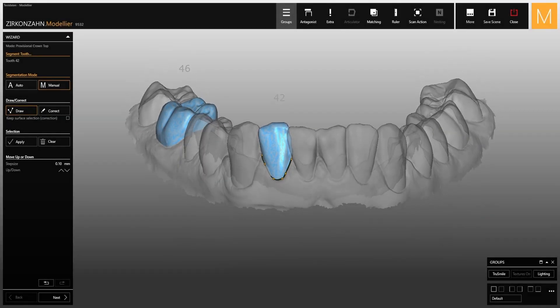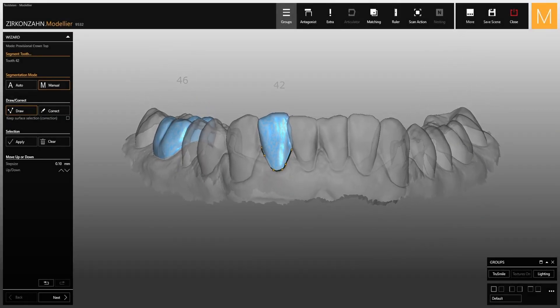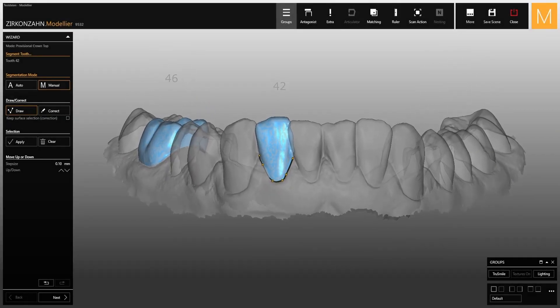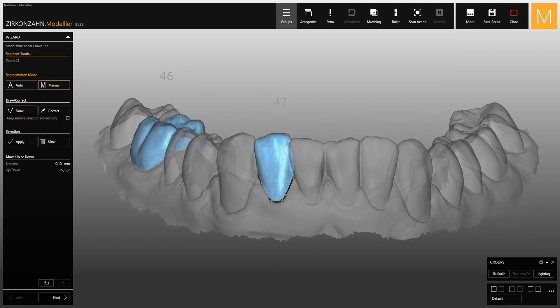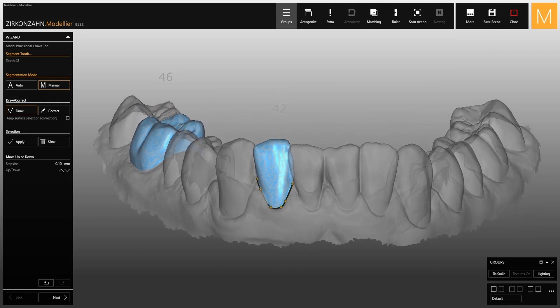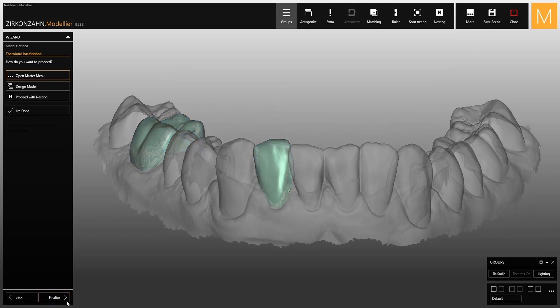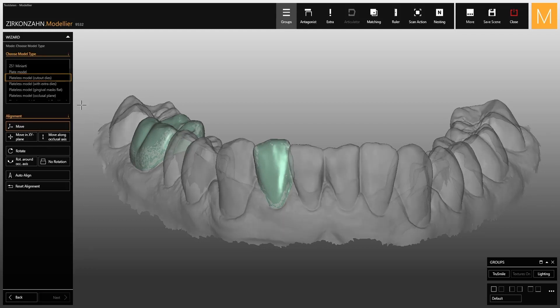This video shows you how to create a model with temporary crowns. Proceed with the design of the temporary crowns until you reach the end of the wizard, then go on with the model creation.